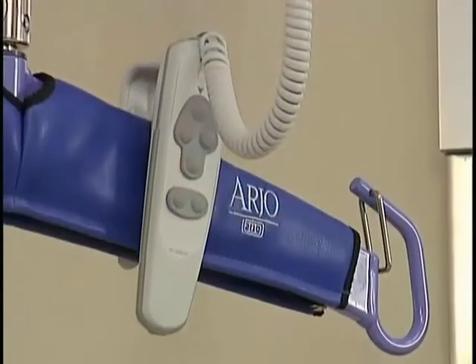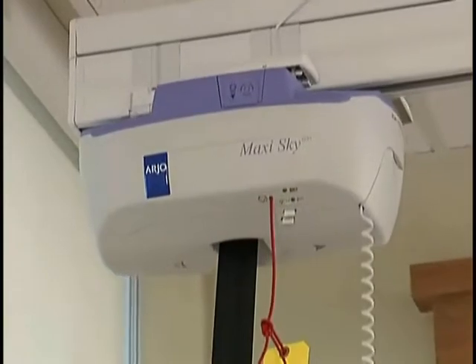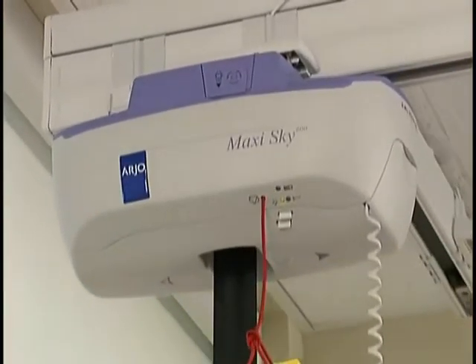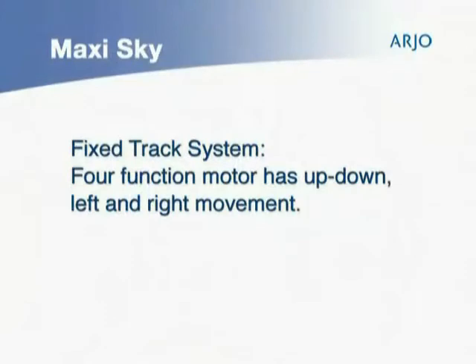The MaxiSky has a hand control to help raise and lower your patient. There are two types of MaxiSky motors depending on the track layout installed. The four-function motor, used on a fixed track system, has up, down, left, and right motorized movement.